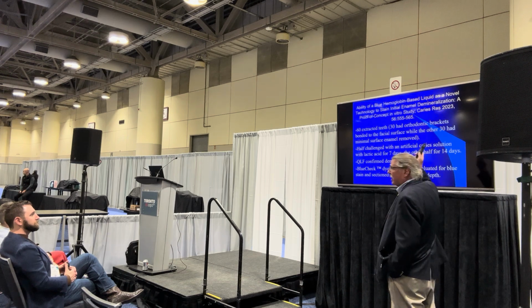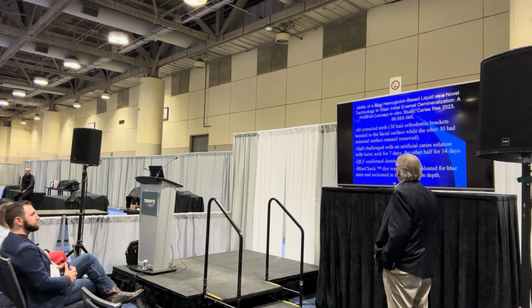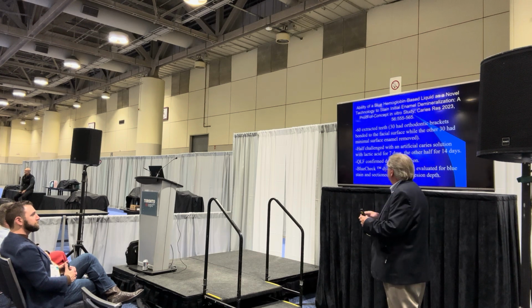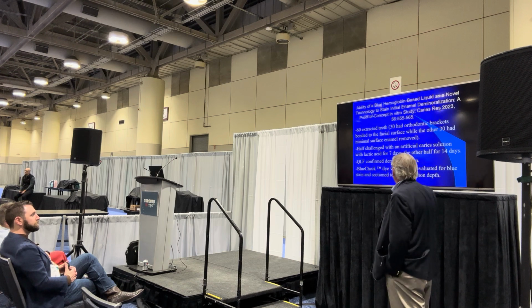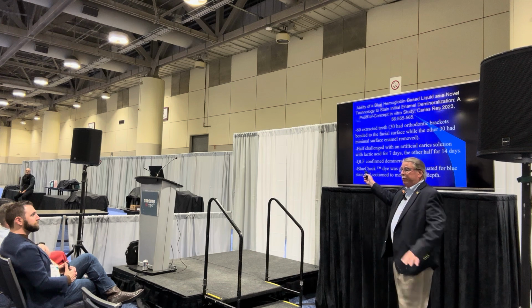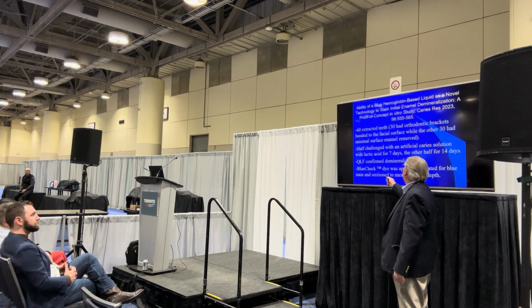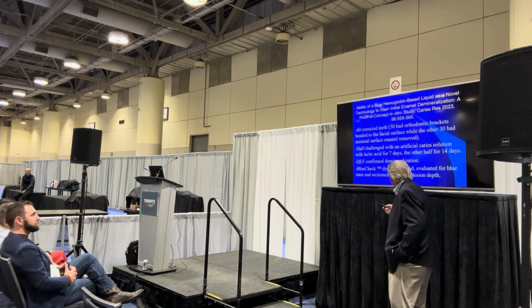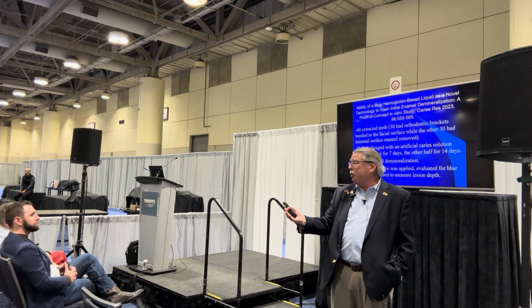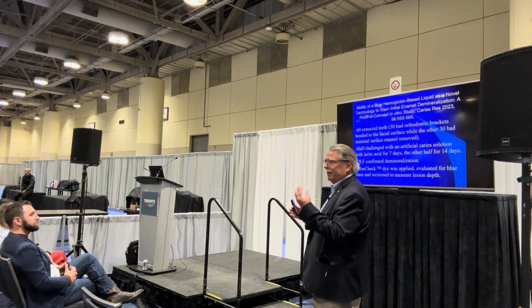So this is a trial published in Caries Research. Caries Research, pretty powerful journal, very difficult to publish in, highly reviewed. 60 extracted teeth, 30 had orthodontic brackets bonded to the facial surface, and the other 30 were just normal, right? Half of them were challenged with artificial caries solution, half from each of those 2 groups, for 7 days and the other half for 14 days. QLF, now remember, that's been validated by us before, confirmed demin, so we know that's accurate. Then they applied the BlueCheck and evaluated for blue stain and wanted to know, what's the depth, and does color respond to depth? That was a real problem with QLF for a while, but I think we managed that relatively well. We had some bioengineering people that worked with us on the true fluorescence, but that's a day of the past.